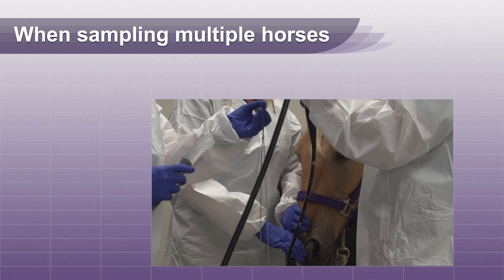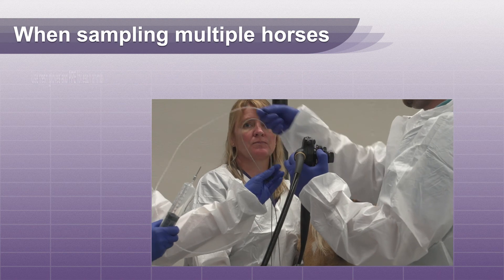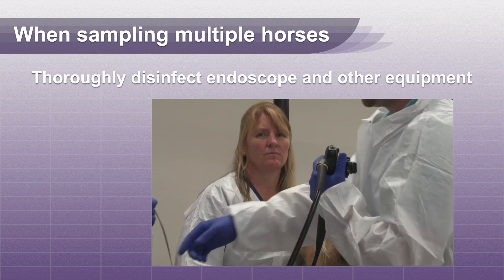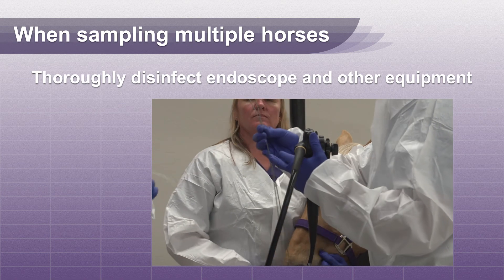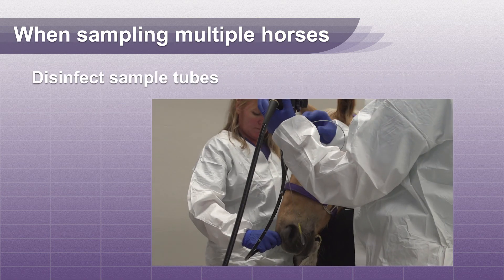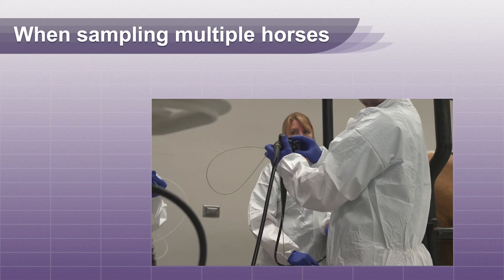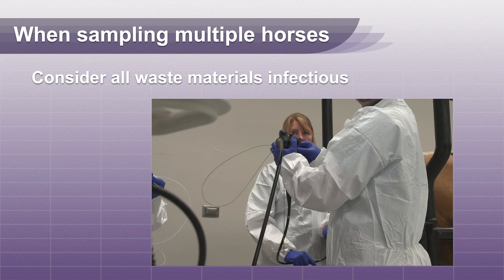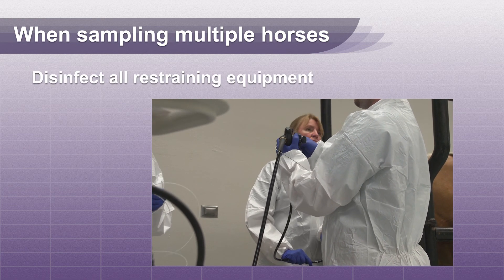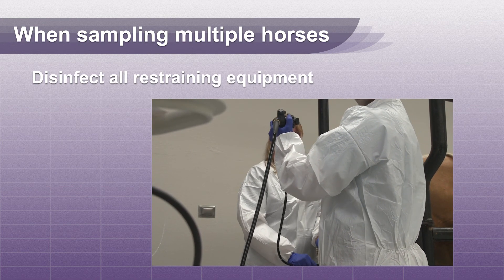If sampling more than one horse, fresh gloves and PPE should be used for each animal. Equipment, including the endoscope, should be thoroughly cleaned and disinfected between horses. The outside of the tube should be wiped down with disinfectant to prevent contamination of other samples or gloves of handlers. Consider all waste materials to be infectious, including gloves. Any restraining equipment such as twitches, nose chains, etc., must be disinfected between uses.